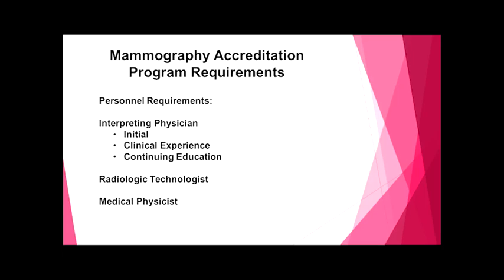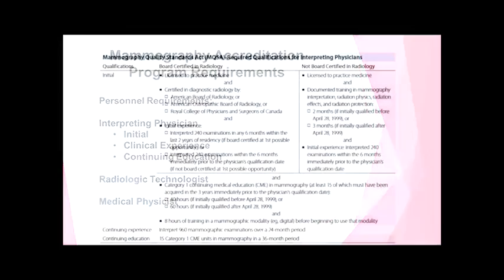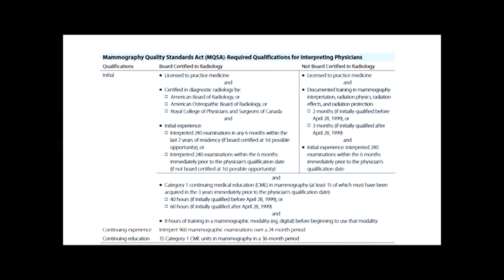And one of those, of course, is personnel requirements with an initial, a clinical experience factor, and a continuing education. Now, we're not going to get into a lot of detail about that, because that's not the overall objective of the training course, but physicians have their initial qualifications that they have to meet.